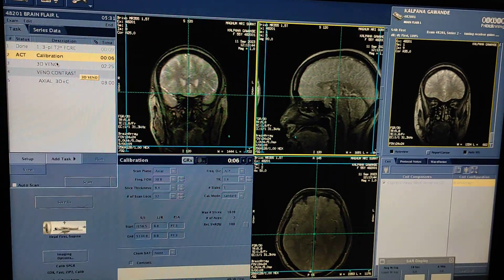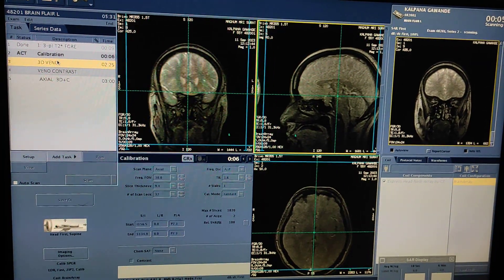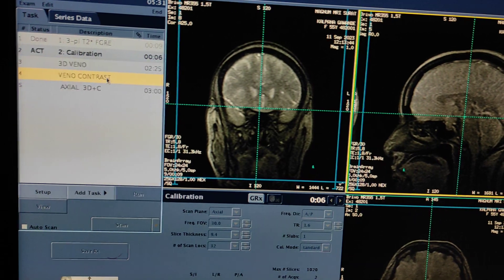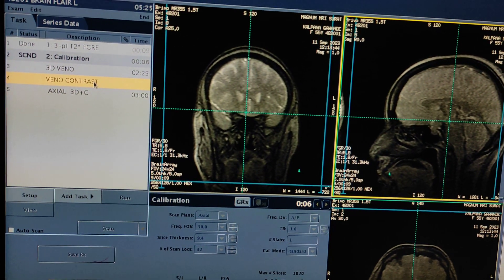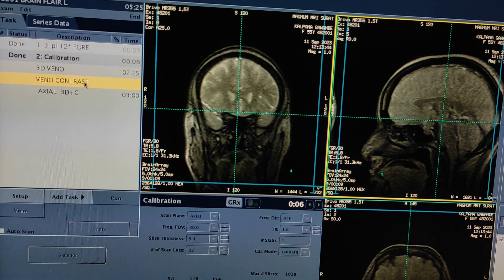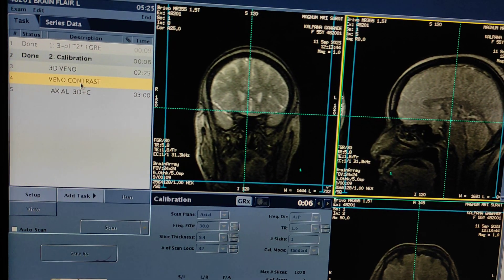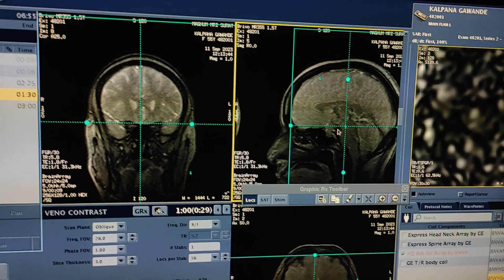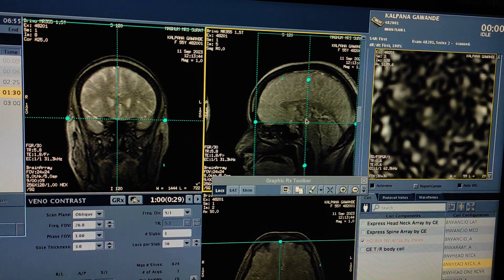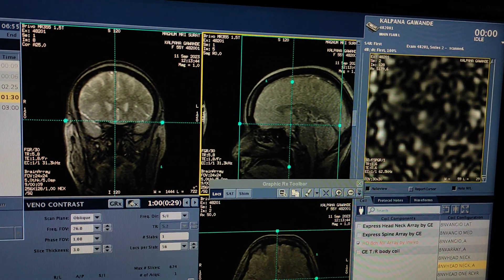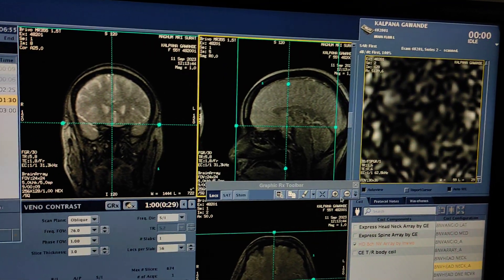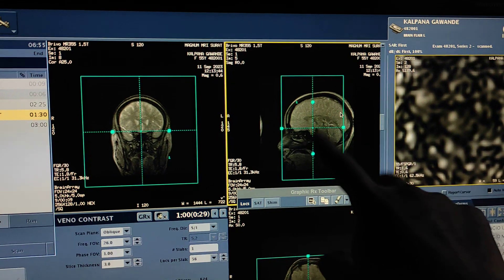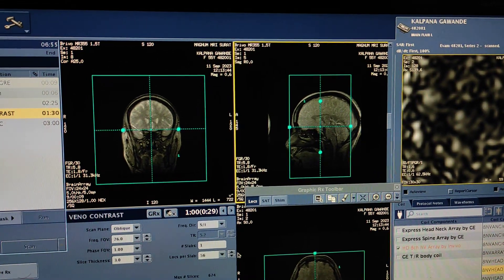You have to run this 3D sequence before doing contrast. Search for the sequence in your protocols. To cover the whole brain, simply set it so all the sinuses will be included automatically.